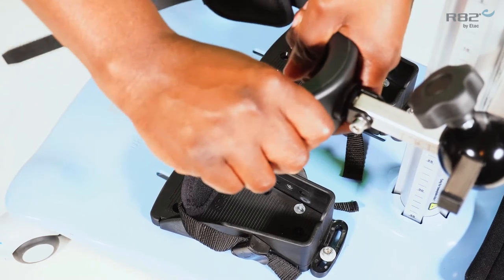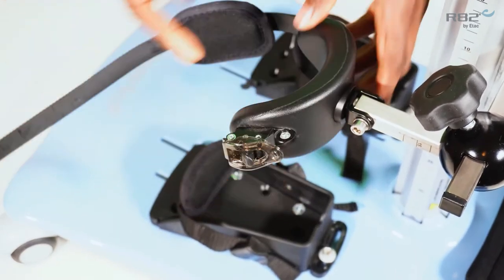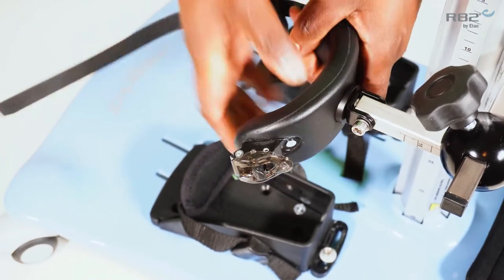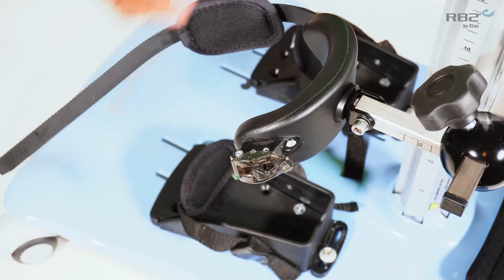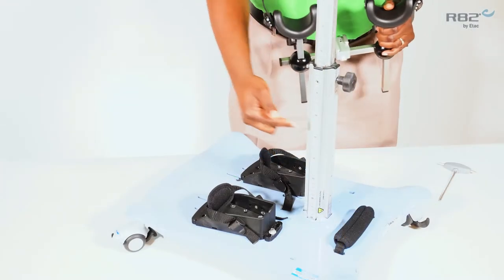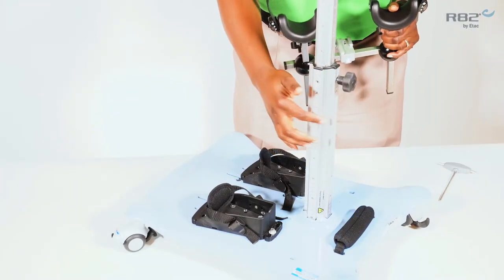The knee supports are moldable. For a larger knee, you're able to open the cup of the knee support, and for smaller knees, you're able to mold them closer in. The knee supports will mount onto the height adjustable column.